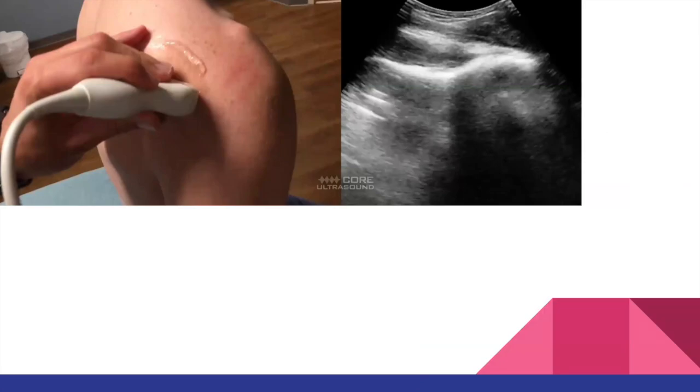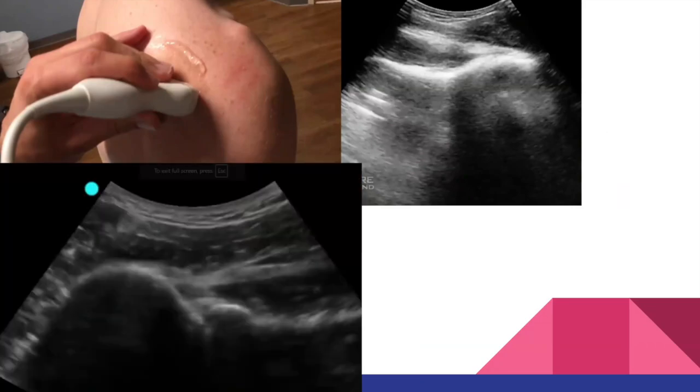So this is a non-traumatic shoulder dislocation, and so you can use ultrasound as your sole imaging modality. If it was related to a fall down the stairs, then you need to get x-rays to make sure that there's no other fractures that you're going to be pulling on this arm during the reduction. But for a non-traumatic shoulder dislocation, you can use ultrasound. And so the anatomy that you're looking at here, you use a curvilinear probe on the posterior part of the shoulder, and you see this is the humeral head here. This is the glenohumeral fossa, and this is a normal alignment with the scapula here. So you're looking for these things to be generally in line.